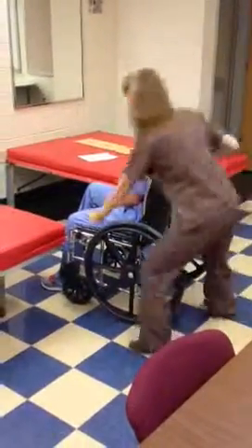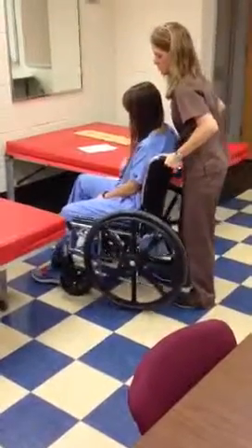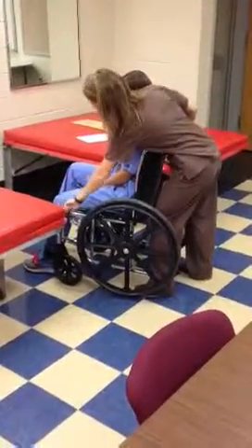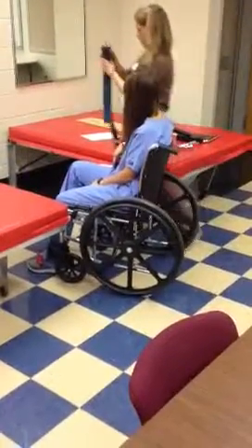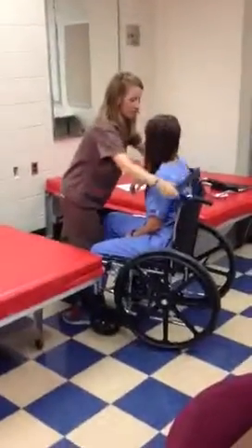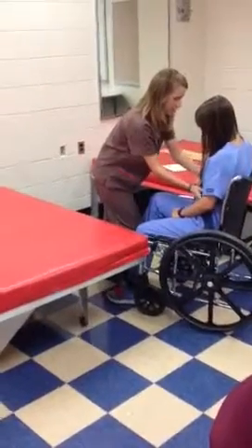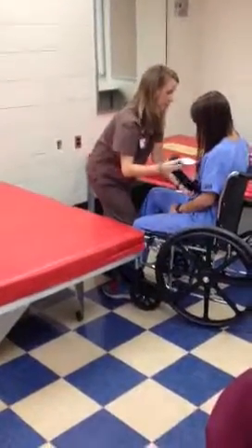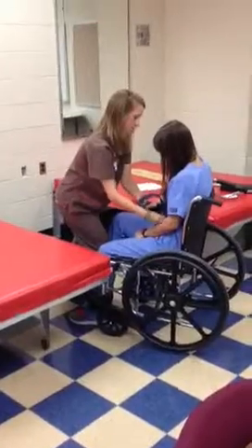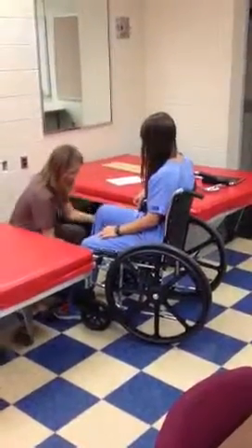We might need to get a little closer. Maybe that's as close as we're going to get. Put on our gait belt so we're nice and safe. Can you lay in bed? I'm sorry. Make sure it's not too tight, not too loose. You think it's okay? Smooth my foot down, swing this out.